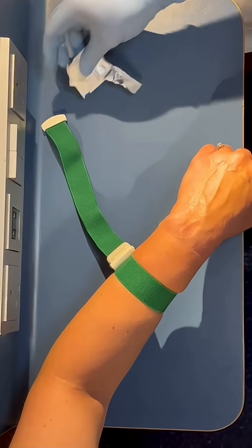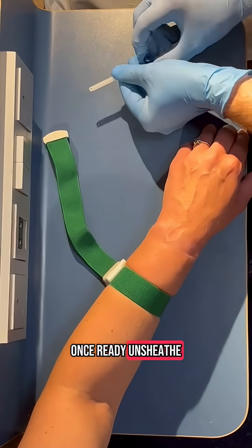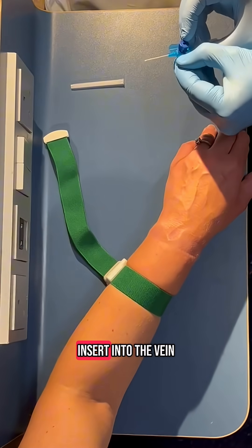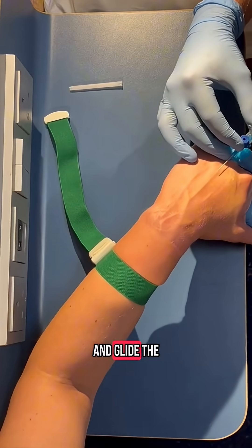Once you have prepared the site, prepare your cannula in whatever way tickles your fancy. Once ready, unsheathe the needle and insert into the vein. Obtain a low angle of insertion and glide the needle forward.